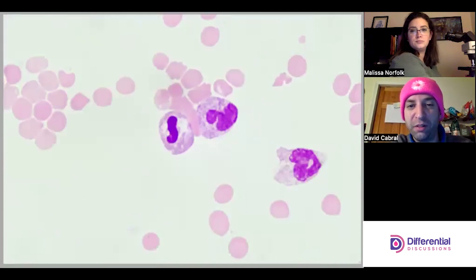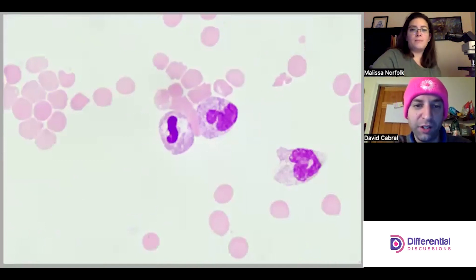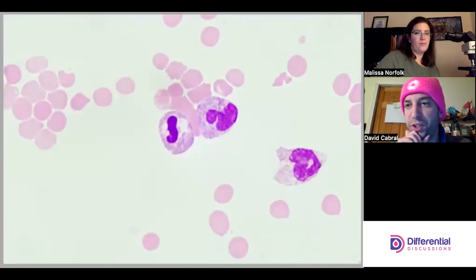More neutrophils here. One looks like it's starting to get a little necrotic or pyknotic, which is normal — neutrophils don't last particularly long, especially outside of circulation.